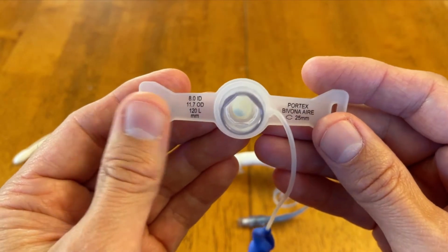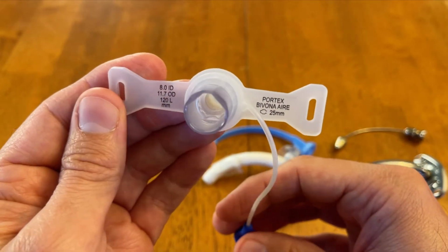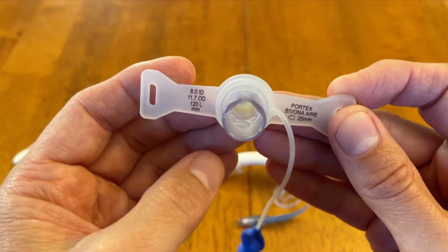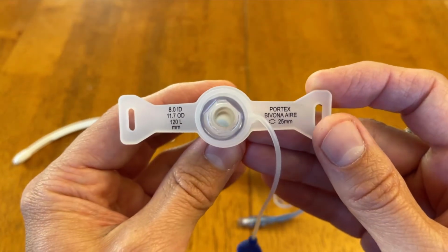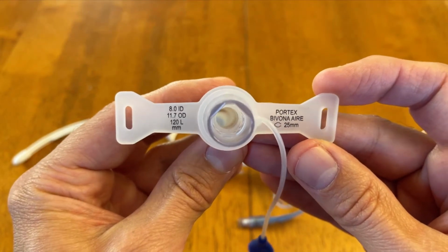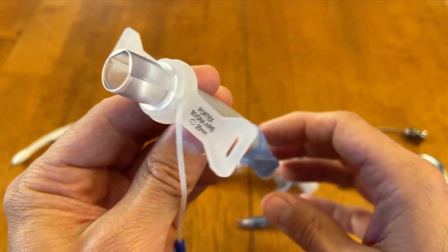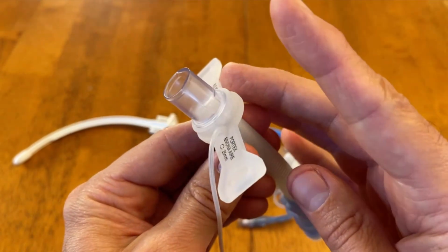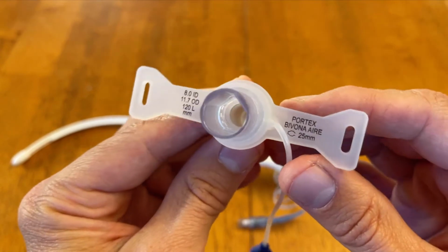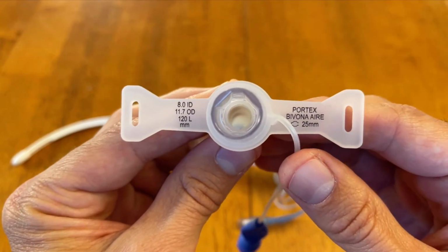If a patient presents to the emergency department, I want to know, is this tracheostomy cuffed or not? And the reason for that is if I were to need to provide positive pressure ventilation, whether by bag valve mask or by a ventilator circuit, I want to be sure that I can instill gas and it doesn't escape out through the upper airways. And so having a cuffed tracheostomy tube is important in those emergency type situations.